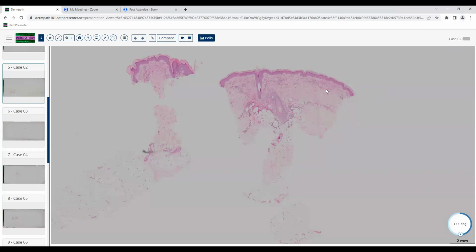Okay. What kind of inflammatory cells do you think we're looking at here? You may not know for sure, but what can you infer is not there? When I think of pink, I think of eos. Okay, good. You think of eos. I'm going to be betting that there probably are going to be some eos here. I agree with you. What else do you think of when you see kind of reddish or pink at low magnification?